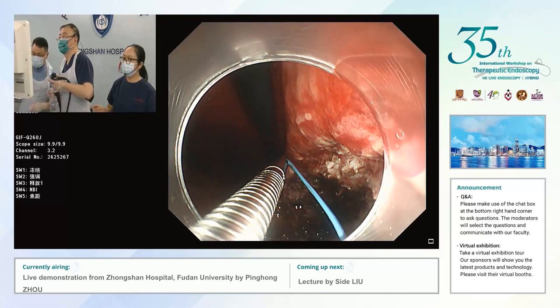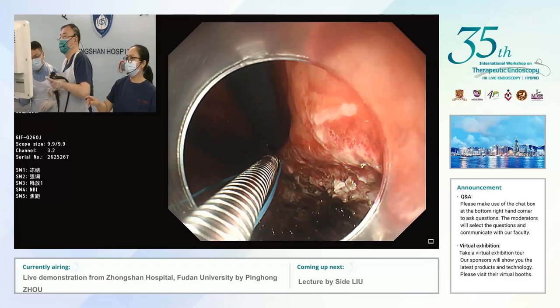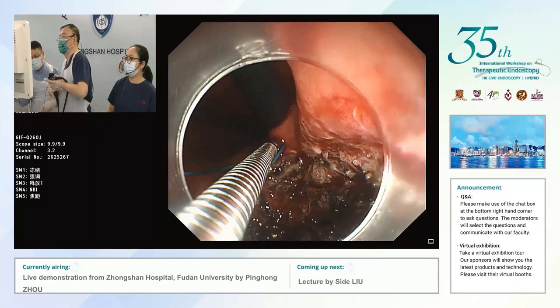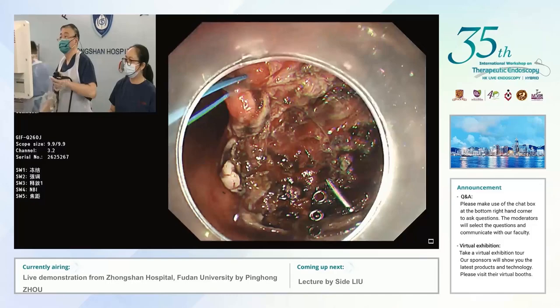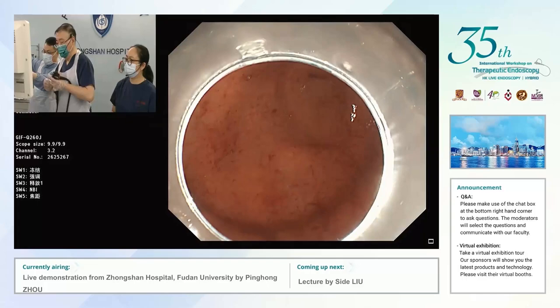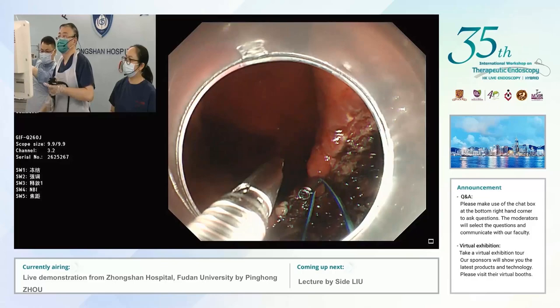We use the clip to grab the end loop and then clip on the edge of the wound. This looks very difficult with such a large defect — it will be interesting to see how this is closed. What is the size of the loop you use, Professor Zhao? Three centimeters.